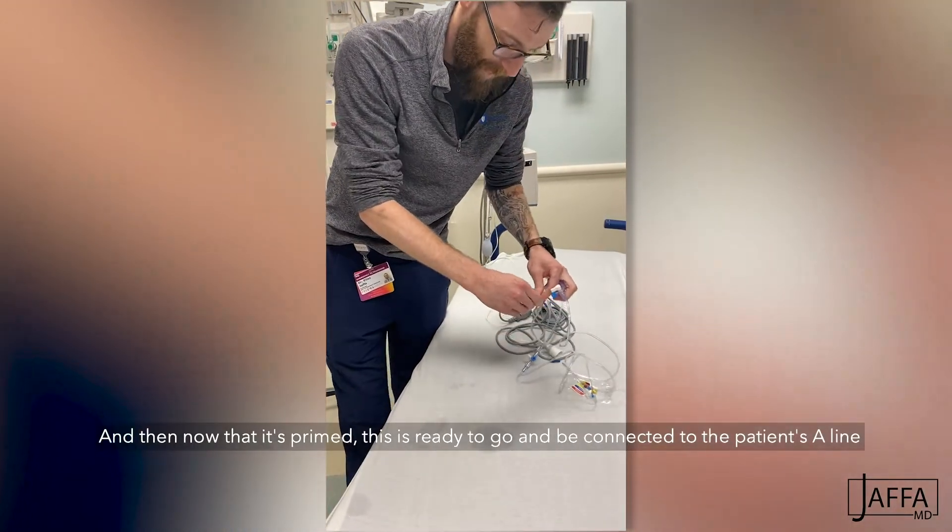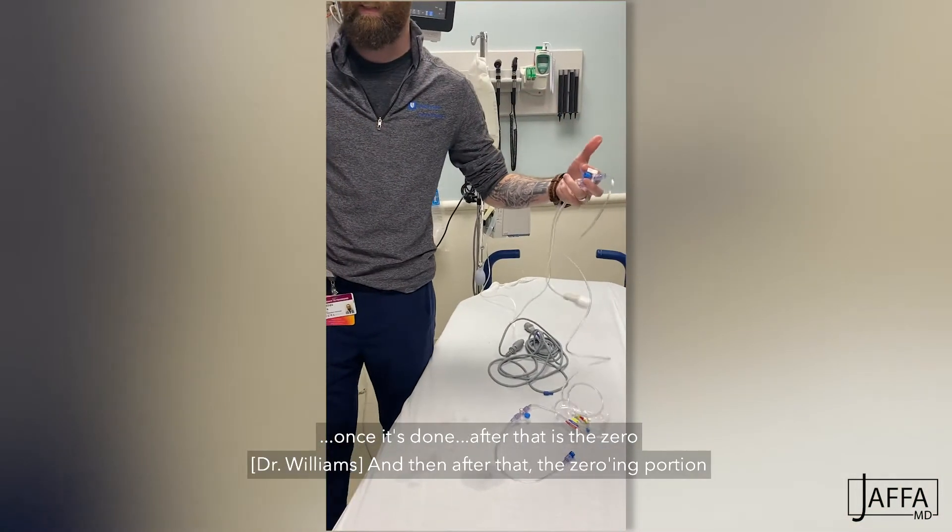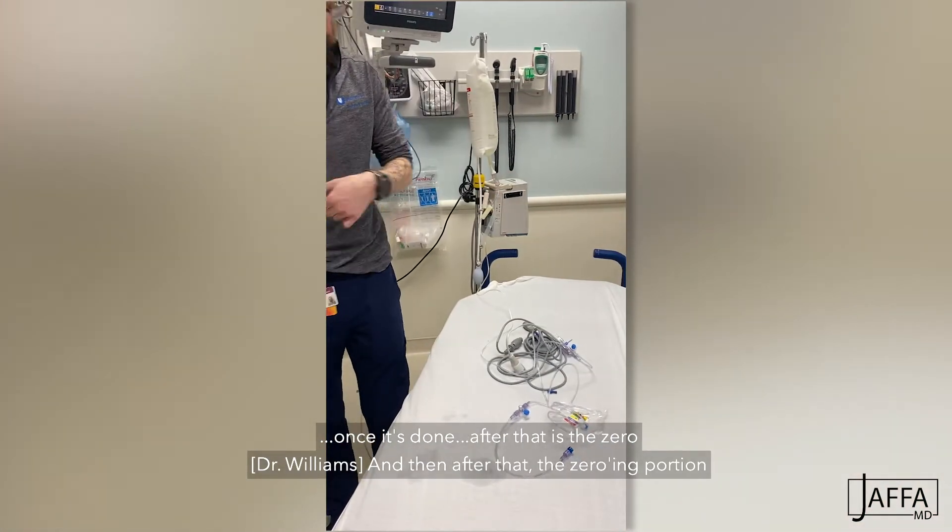Now that it's primed, this is ready to go and be connected to the patient's A-line. And then after that comes the zeroing portion.